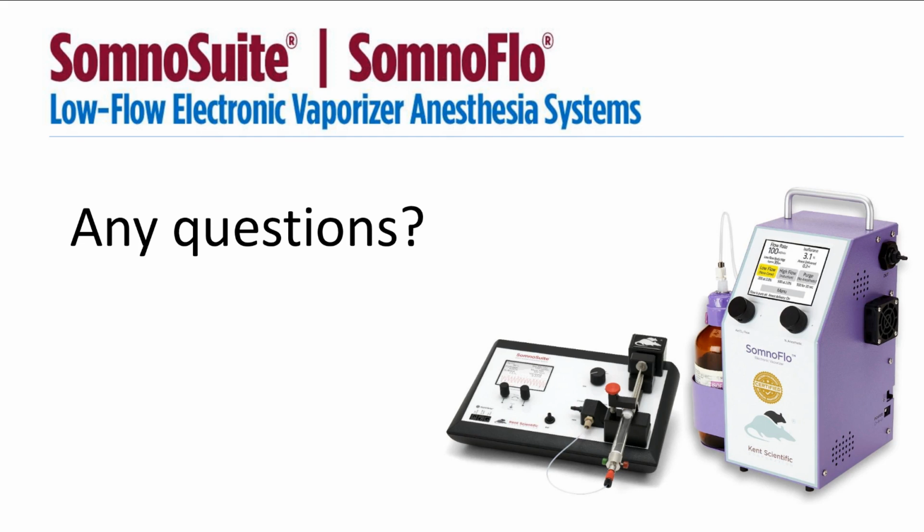Okay, fantastic. Give you guys a couple more seconds on that poll. And then I will move on to the last polling question. So this polling question is, do you regularly find the need to provide supplemental oxygen during your surgeries? Always, sometimes, or rarely? So I'd love to get your feedback here, everyone. Thanks so much for being here and for participating.